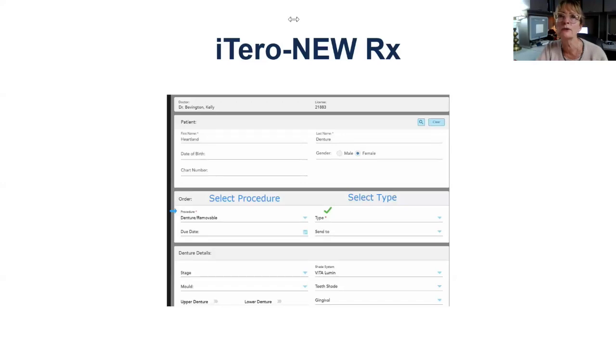What color of wash impression material do you recommend when doing a reference denture? So we wouldn't use impression material on a copy, only on a reference. I tried it once and it took me hours. Oh, I'm sorry, to scan it well enough. Yeah, 1.5 years ago is right about the time when iTero came out with a new RX and workflow, which I've got right here in front of me. So it may have been before that. And the trick was knowing when to turn AI on or off, Dr. Murray. That was the big deal.